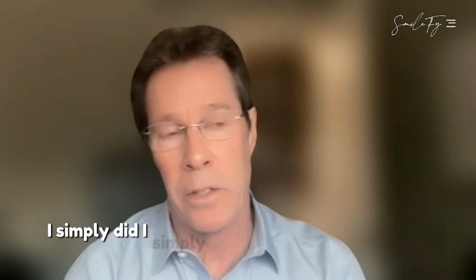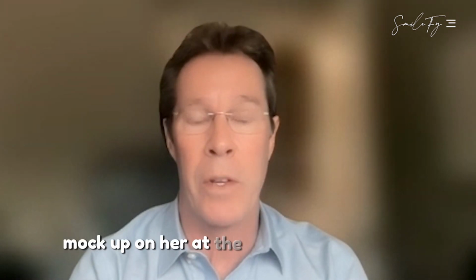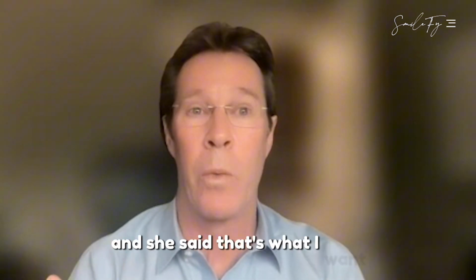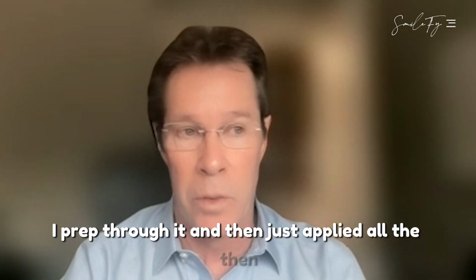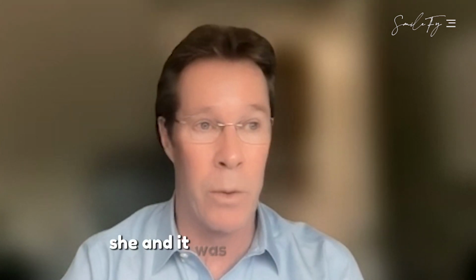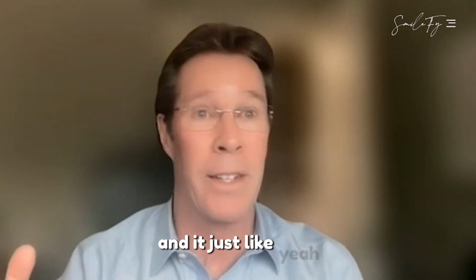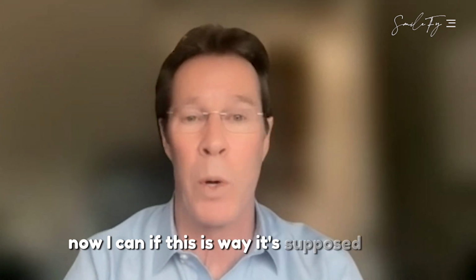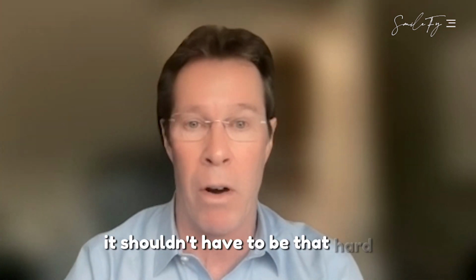I simply made a design and did the mock-up on her at the second appointment, and she said, that's what I want. I prepped through it, and then just applied the composites. So that was easy. It was easy, it was fun, it was enjoyable. And it was really rewarding because she loved what she saw. And it's just like, now I can, this is the way it's supposed to be. This is the way dentistry should be. It shouldn't have to be that hard.